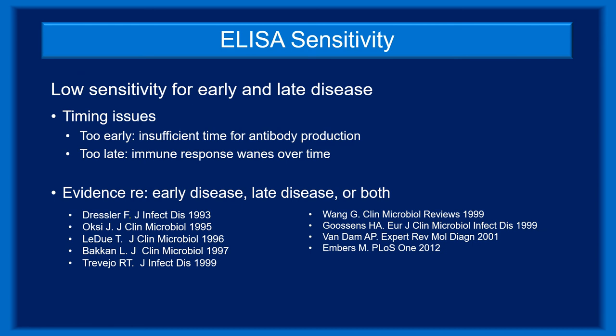There is also concern about the sensitivity of ELISA testing. Low sensitivity for both early and late disease has been well documented. Some of this is attributable to timing — tests done too early in the infection, before the immune system has time to develop antibodies, will naturally produce false negative results. But testing can also occur too late. Individual case reports suggest that the immune response to Borrelia burgdorferi wanes over time, such that infected patients, even those never treated, may have negative results. This was well documented in non-human primates infected with Borrelia burgdorferi — untreated animals were originally C6 ELISA positive but over two years became C6 negative, even though bacteria were readily apparent at necropsy.